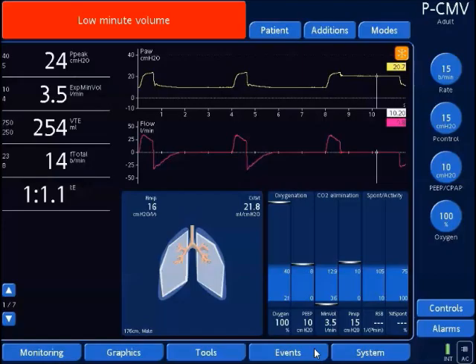Before showing how to obtain plateau pressures with various modes, I'm going to provide an overview of the ventilator screen if you're unfamiliar with it — this model, the G5.